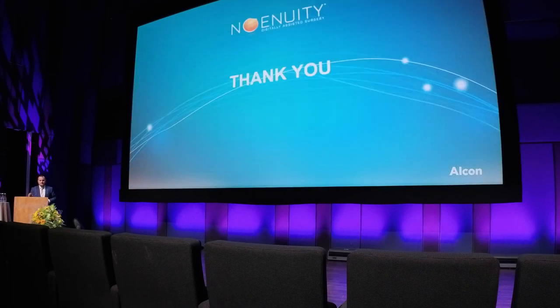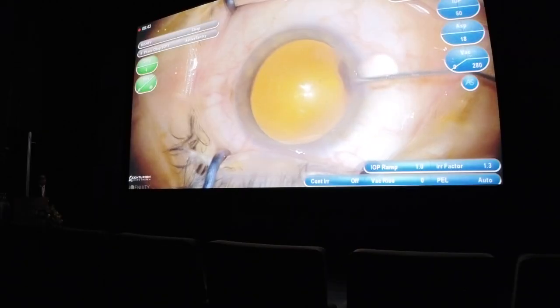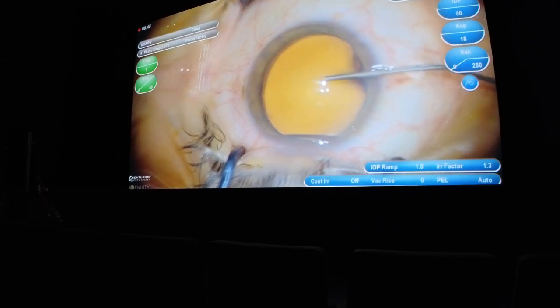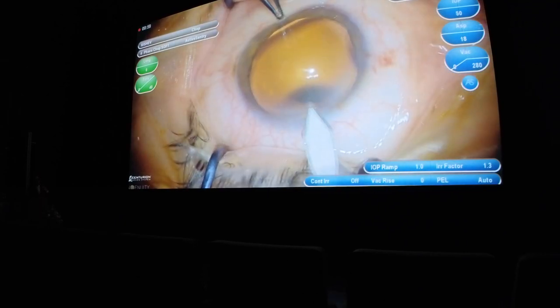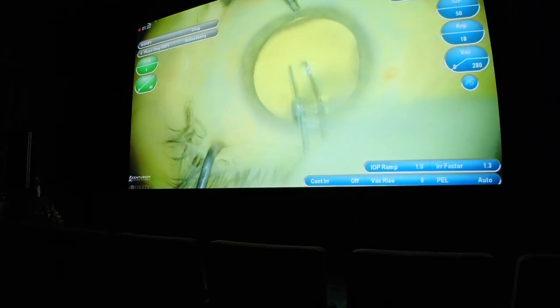These are the references. Now I will ask you to place your 3D glasses because we will have a 3D movie presentation. This is a typical anterior segment case and you can see the overlay of the Centurion.